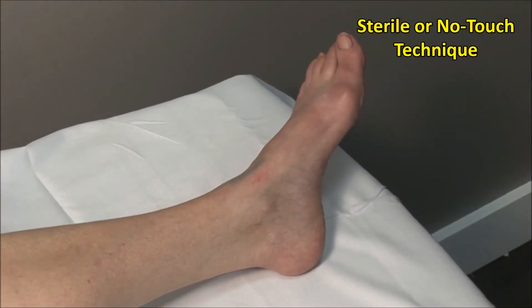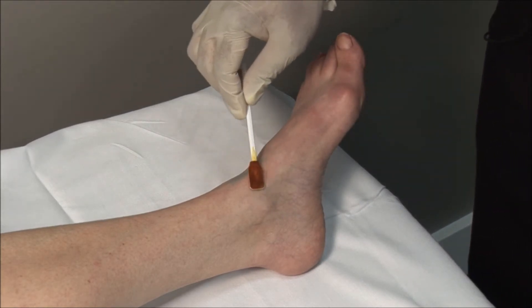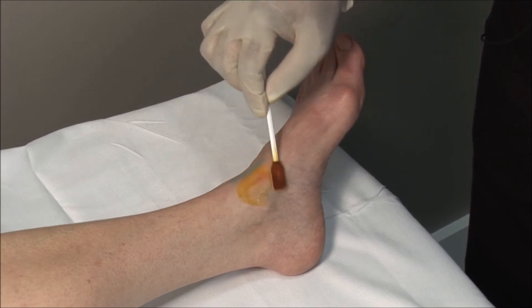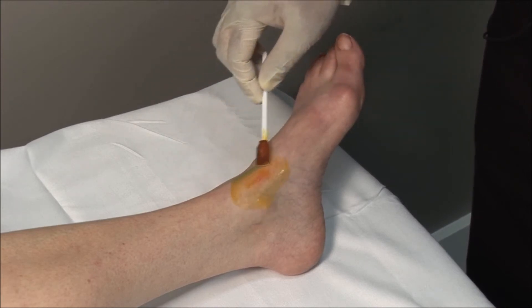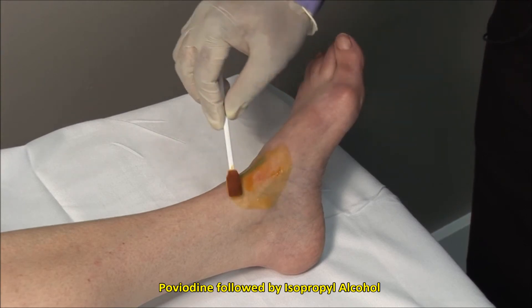These injections should always be done using sterile precautions. A no-touch technique is used, meaning that once the area is cleaned, it must not be touched with anything but sterile needles. Scrub the site and then clean in an outward fashion. I am using povidone-iodine and following this with isopropyl alcohol.